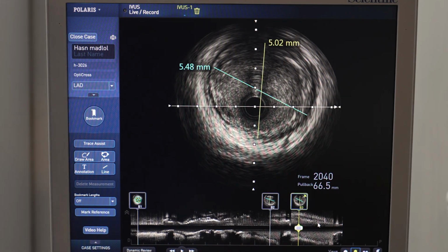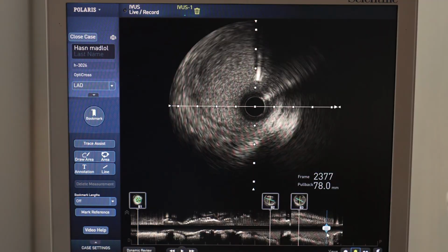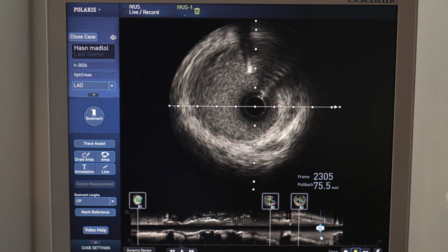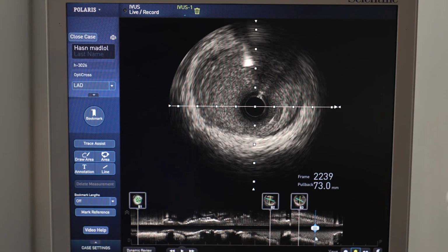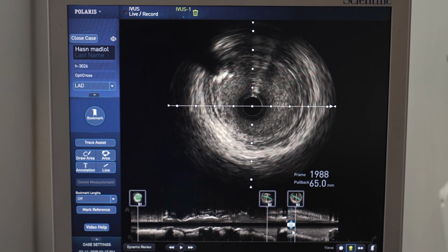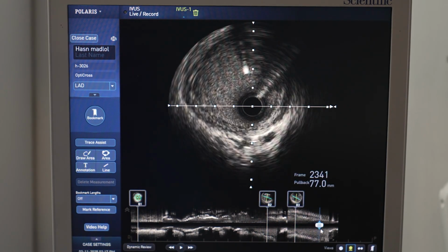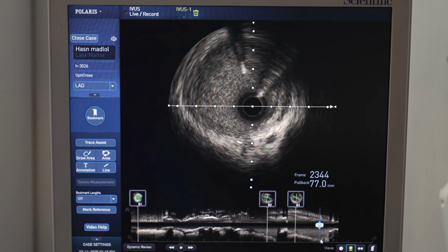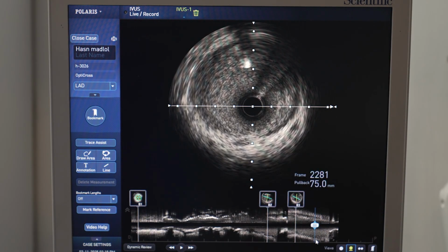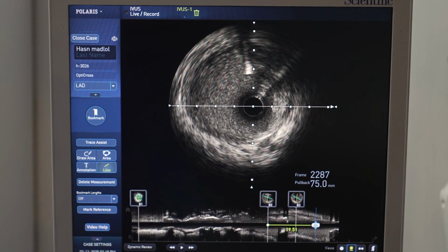okay. Now we can analyze the length since we are doing automatic pullback. The ostium of the left main stem is clear, and we can put a stent up just before the ostium here, and the LAD up to this point. So let's measure the length by IVUS and see what stent do we have. Of course, after more pre-dilatation. So an 18-20 would be enough.